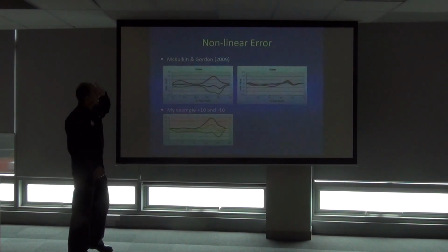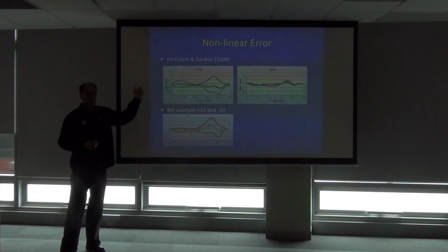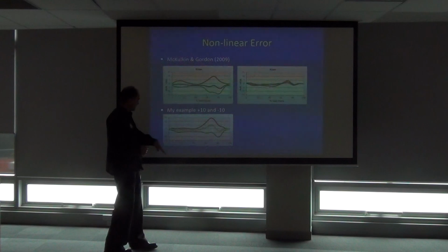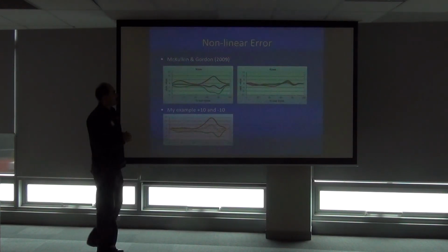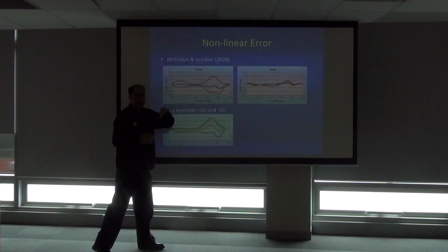Here, this is some data that was presented in the literature. You look at it and you can immediately see exactly what's going on there. Externally rotated, almost identical to what was in here, externally rotated thigh, and almost identical thing going on here. And this one, slightly externally rotated, slightly towards this way.